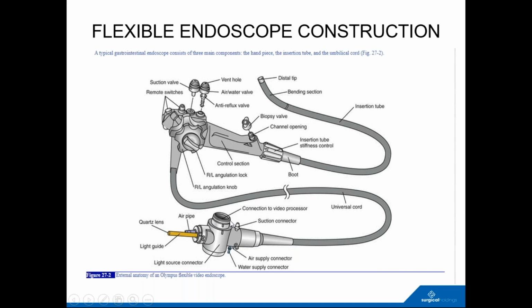But leaving that off and then putting it into the fluids is a classic. It's a very simple thing to do, and you just forget. Then the compromise is in the internal channels, from using sharp instruments through them. If it's going through a bend like this and the instrument is fairly rigid, it can puncture here. A small puncture may not be noticed immediately, but it can cause a problem.